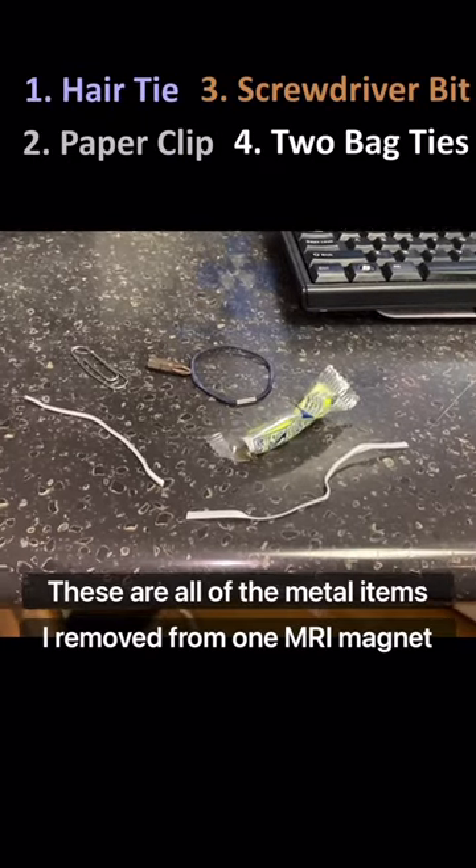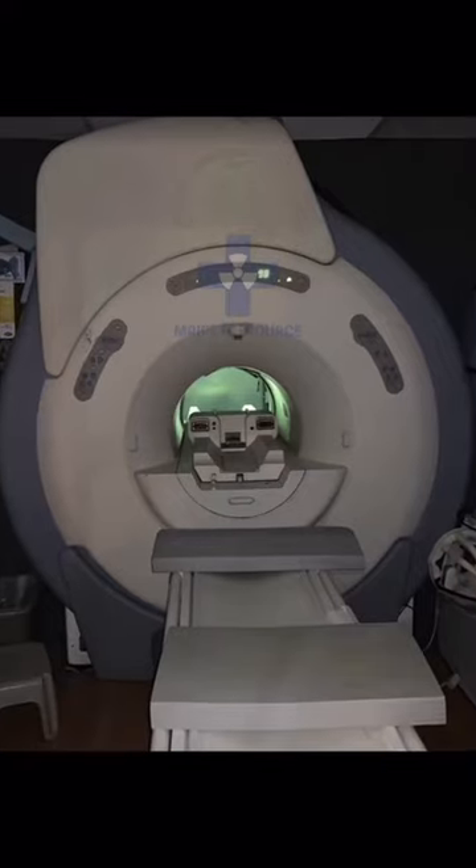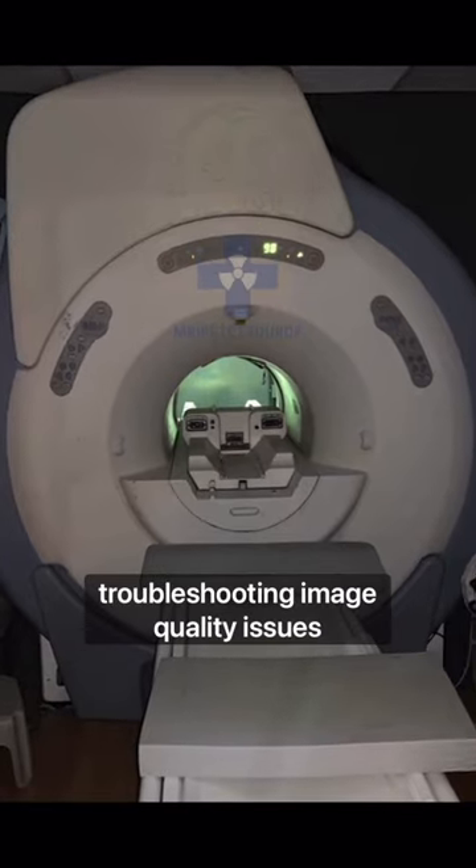These are all of the metal items I removed from one MRI magnet. Today I'm in a mobile MRI troubleshooting image quality issues.